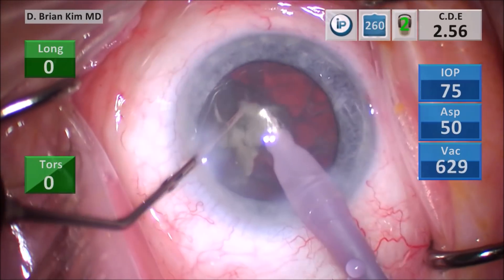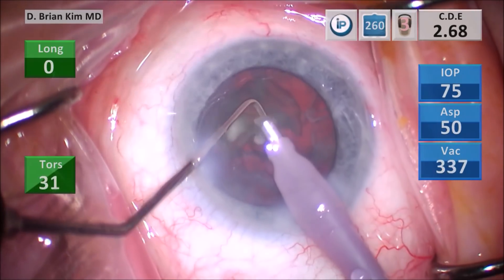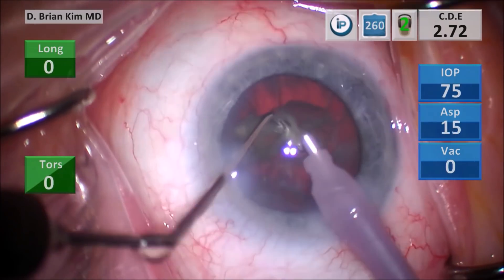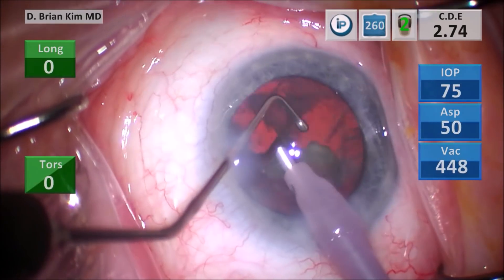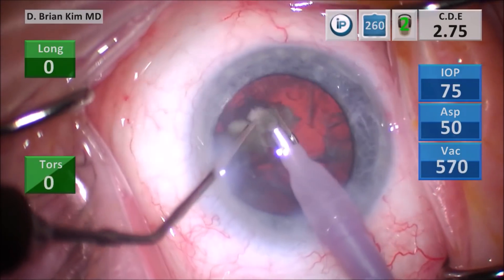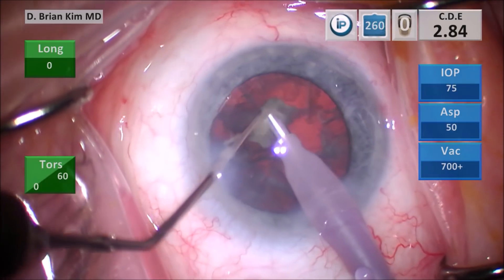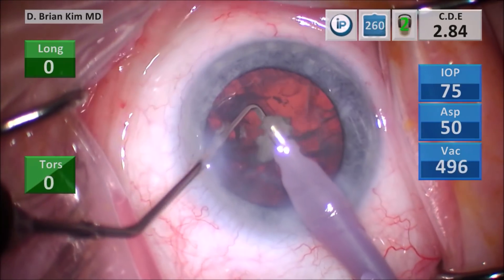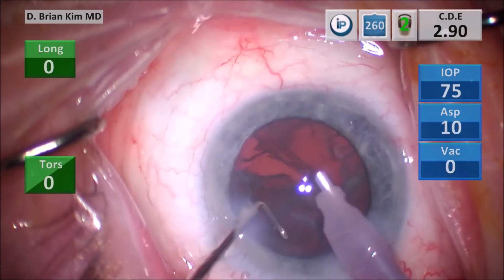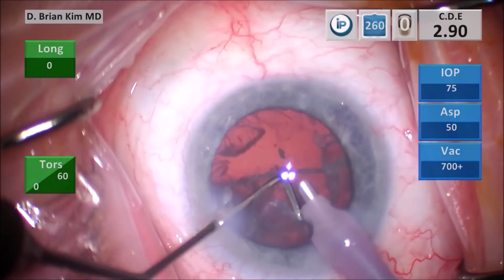I'm directing the lens material in between the instruments, crushing and pulsing. When you're emulsifying the last quadrant, you want to make sure you keep that chopper deep in the capsular bag so the bag doesn't come forward. You can continue to crush, but remember: when you're crushing, you're not initiating vacuum or ultrasonic energy — this helps reduce your risk of breaking the bag. When you're crushing, there's no action except irrigation. After you crush, you place the chopper deep and then go ahead and emulsify the lens material.